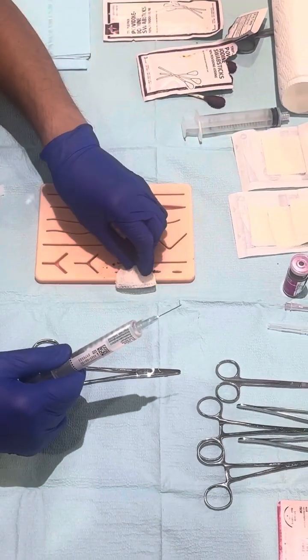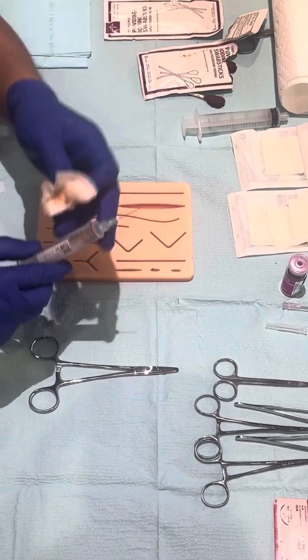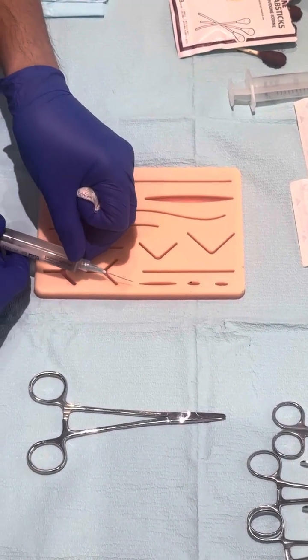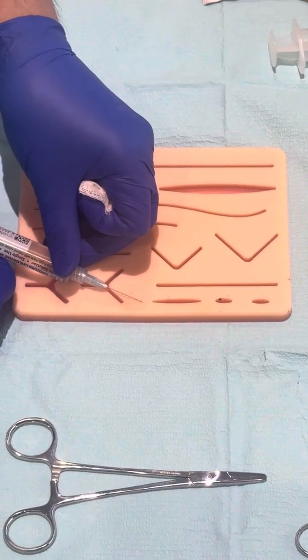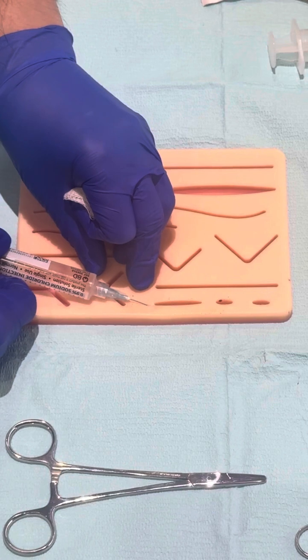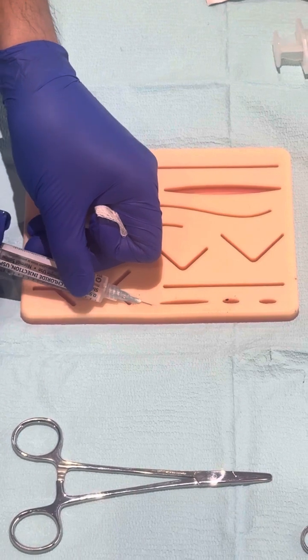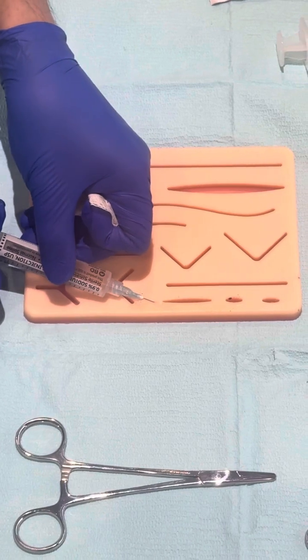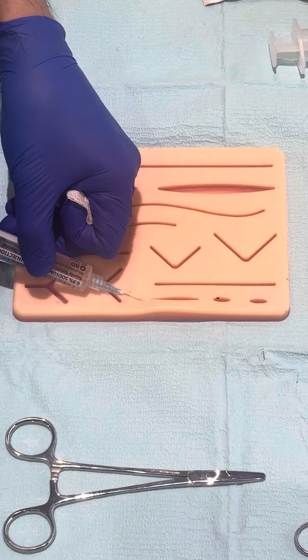First, clean the area and wipe it off with your betadine. This is all a sterile field. Inject the anesthesia using a diamond shape. First, at the edge of the wound, assuming you're at the half of it, insert the needle, and as you withdraw the needle, you introduce the anesthesia. At least 1 ml on each side as you withdraw.